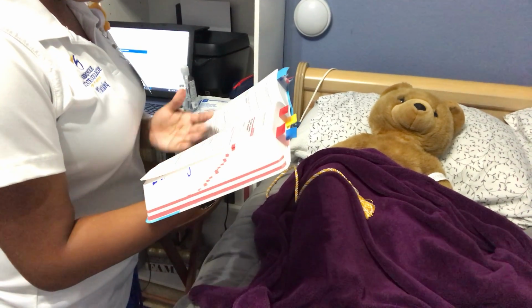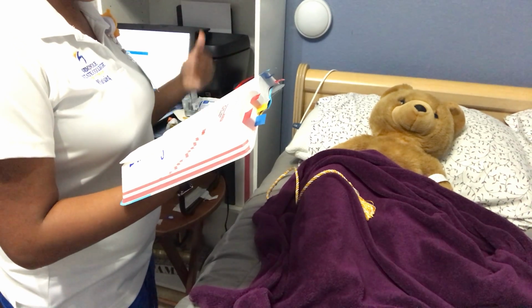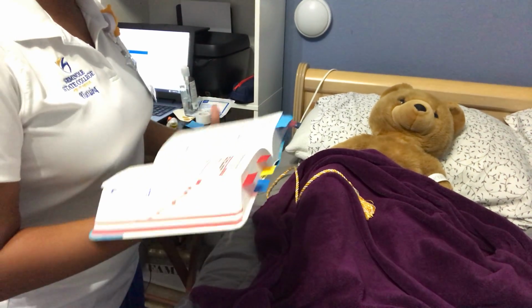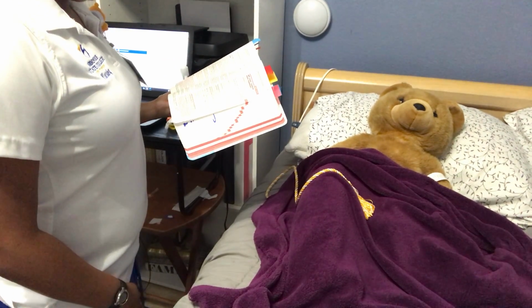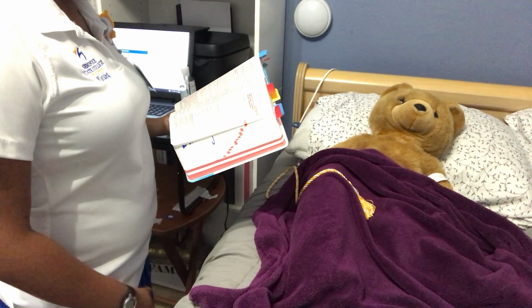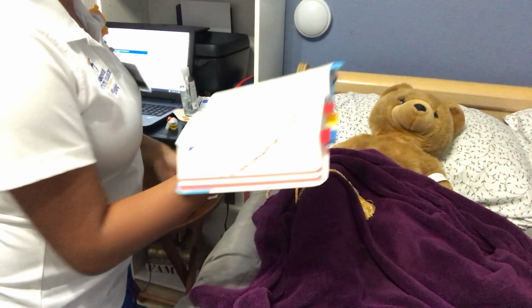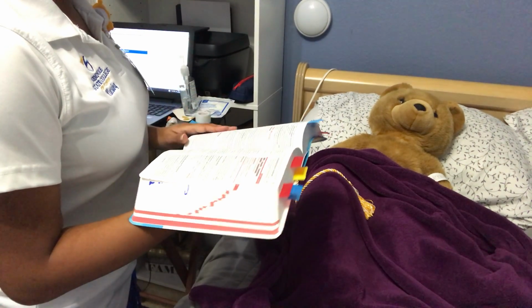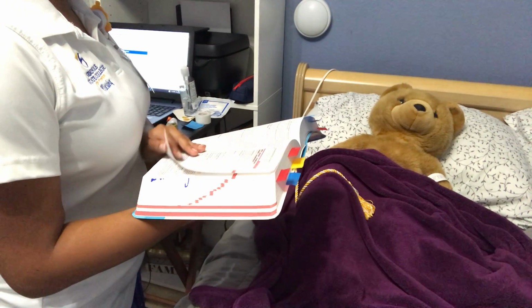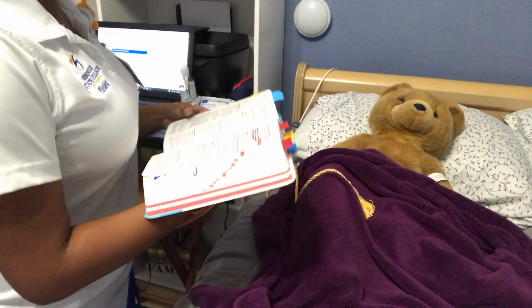Alright. And I just wanted you to know that since it is a subcutaneous injection, I am going to have to rotate injection sites. Since I did it at the anterior aspect of your thigh, I'm going to do it at the anterior aspect of your thigh. The next location would probably be the posterior aspect of your arm, or the abdomen below the costal margin to the iliac crest, like around here. Okay, that's fine?